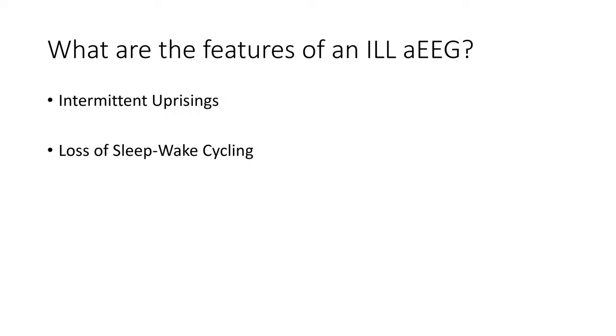I see this a lot in the cardiac babies. They're kind of plugging along on PGE. They have low mixed sats that we are expecting. And when you monitor them with aEEG, they have okay background patterns. So their voltage is good, but the hypoxia just does not allow their brain to organize into that rhythmic sleep-wake pattern that you would expect for their age. And it's just one of the hallmarks that I've seen over the years of this loss of cycling.